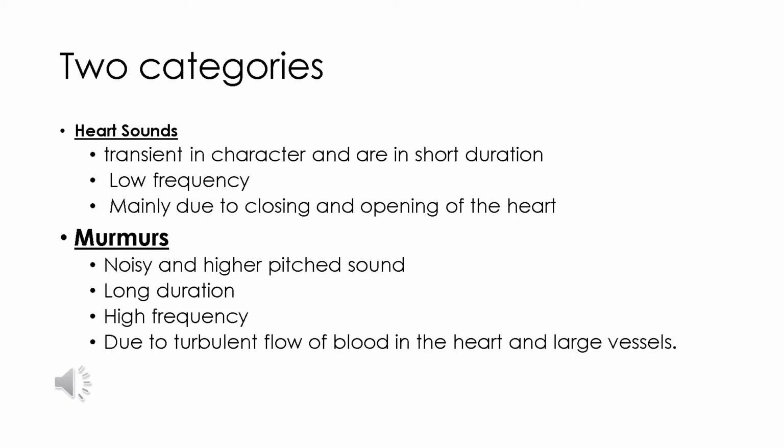There are two categories of sounds connected to the pumping of the heart. One is the heart sounds and the other one is heart murmurs. Heart sounds are transient in character and are of short duration. They have low frequency and are mainly due to the closing and opening of the heart valves. Mechanical working processes of the heart produce sound which indicates the health status of the individual.